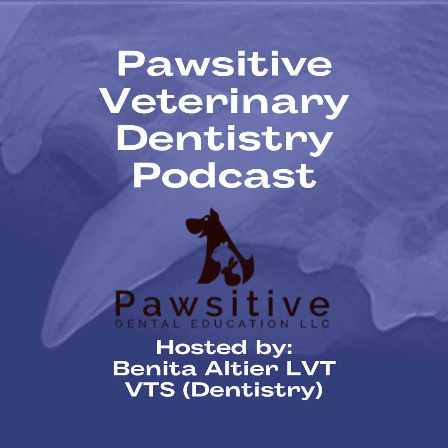Dogs, alternatively, are a little bit trickier because, in theory, crown amputations are not accepted practice in dogs. And I think it's just because we don't have the long-term follow-up for those particular patients. We don't necessarily know if that is an accepted treatment or if that's going to cause problems in the future. The problem is that those teeth are just as fragile as the cat teeth, only they're bigger. So I think that can be very, very frustrating. And I think everyone accepts that cats get tooth resorption. Everybody accepts that. But then they're like, oh no, what happens when it happens to a dog? And we kind of lose sight of what we're supposed to do.